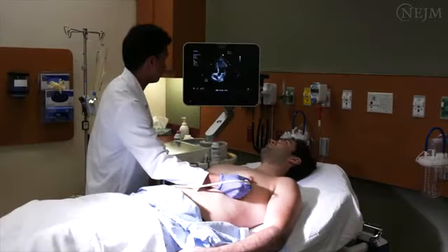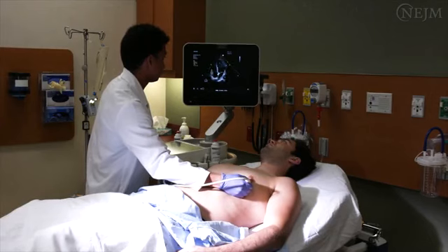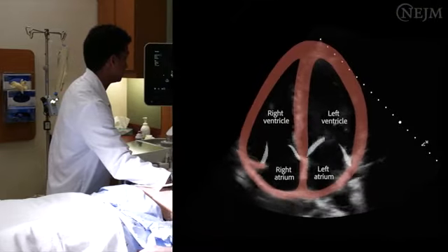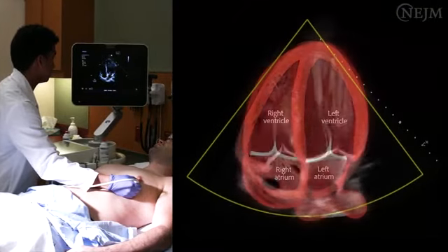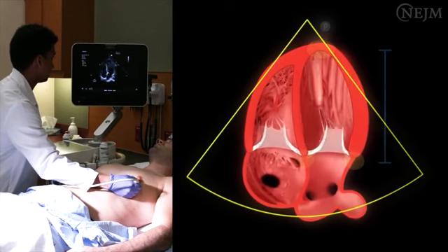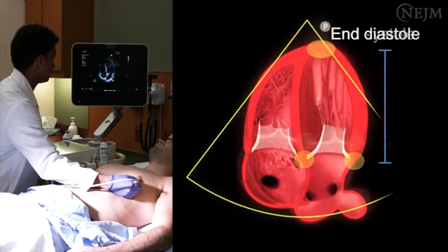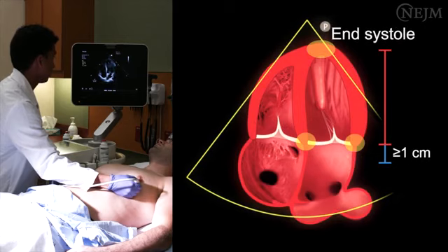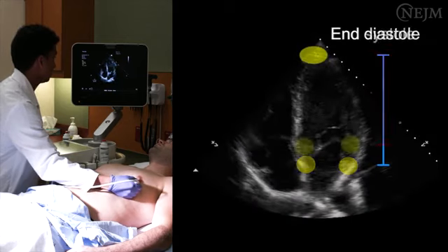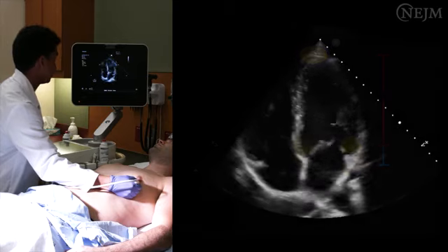Left ventricular systolic function is a cornerstone of management in the vast majority of cardiac diseases, and it can be better characterized with appropriate use of focused cardiac ultrasonography. Four echocardiographic measures in the left ventricle, longitudinal shortening, anterior mitral leaflet motion, thickening of wall segments, and change in the area of the cavity, can facilitate a qualitative or semi-quantitative assessment of the left ventricular systolic function.